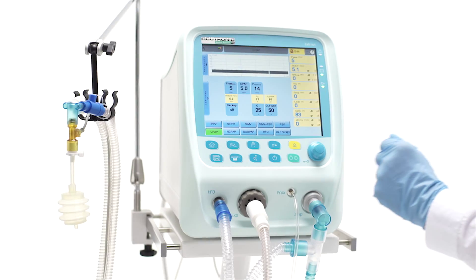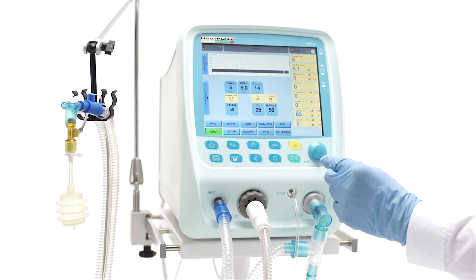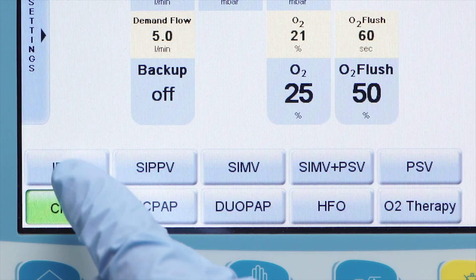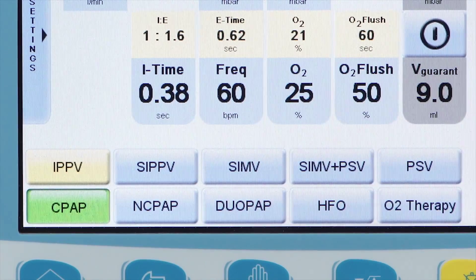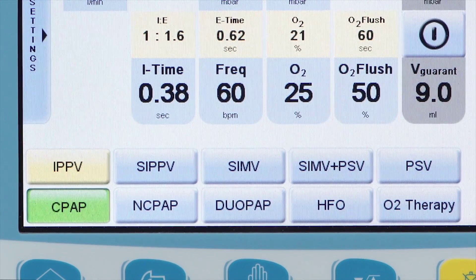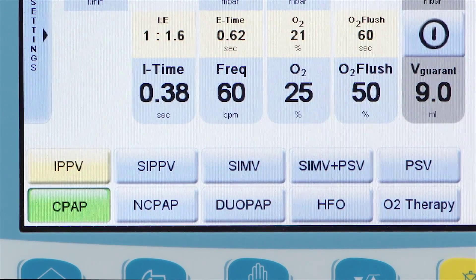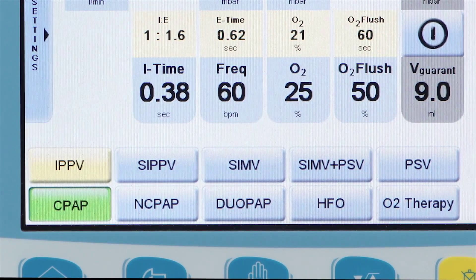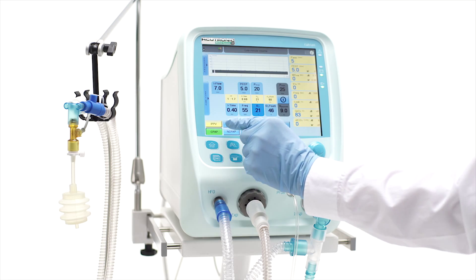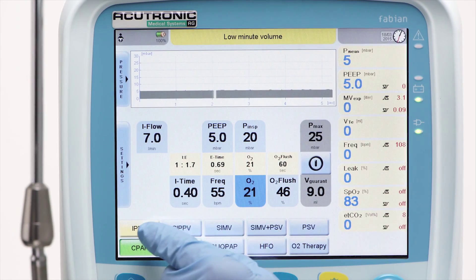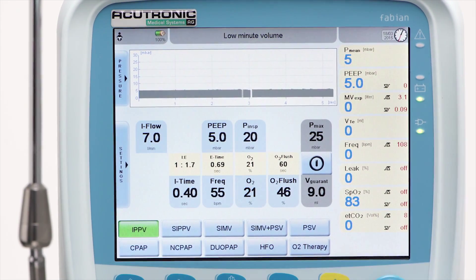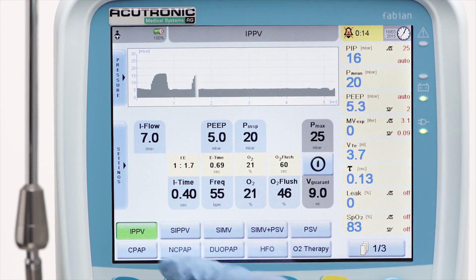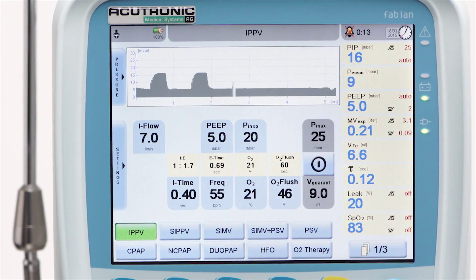To select the mode, touch the related button once. The button changes color from blue to yellow. Now the parameters can be preset. To confirm the mode, touch the button again. Its color will now change from yellow to green.